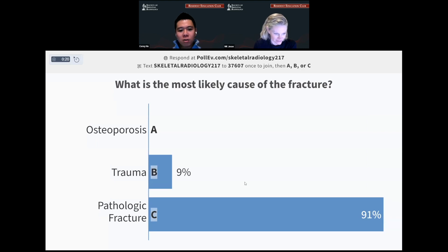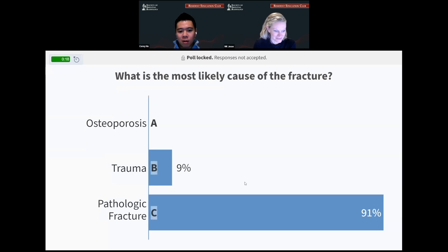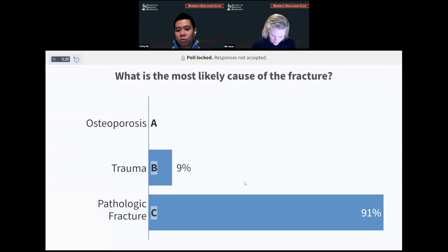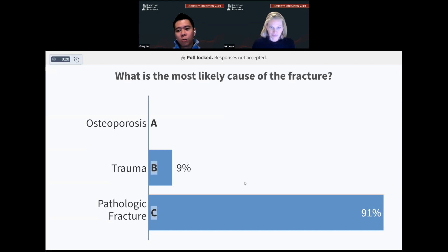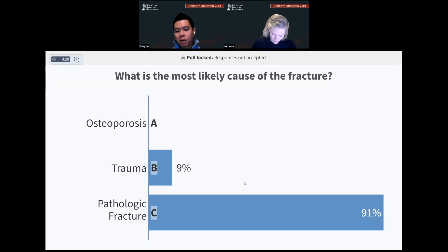Nearly 100% of you chose pathologic fracture, and in fact that is the correct answer. Theoretically, trauma is also correct, because obviously the patient did have some trauma probably to cause that. The reason why we're calling it a pathologic fracture is because there's abnormal signal within the bone of that vertebral body, meaning there's abnormal bone in there. So it's pathologic and it's fractured — a pathologic fracture of abnormal bone.